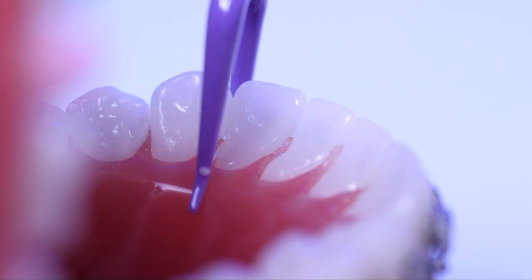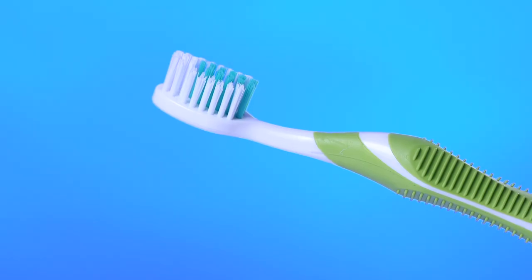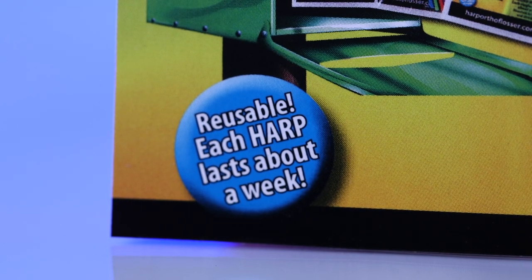We call this power flossing — with no fuss, no hassle. Plus, it's reusable like your toothbrush. You wouldn't toss your toothbrush after using it once, would you? Each flosser lasts about a week with daily use.